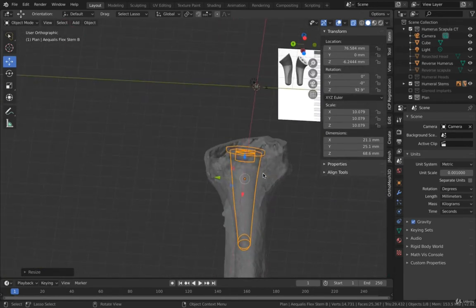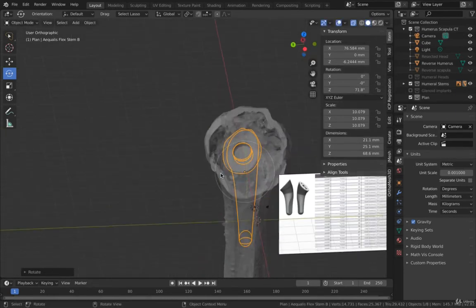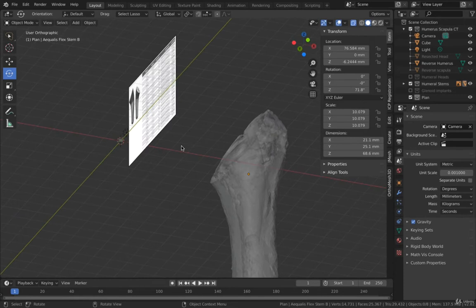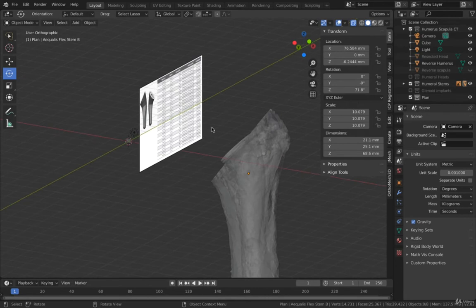Our cut is a little bit tilted this way, so we're going to have to tilt also our stem, so I'm going to rotate it a little bit on this axis, which is the Z axis. And then this is the cut we have selected, and we're ready now to put the humeral head on, the prosthetic humeral head.